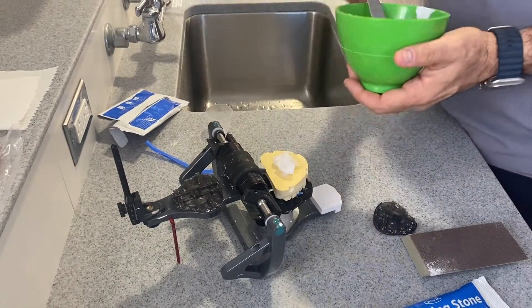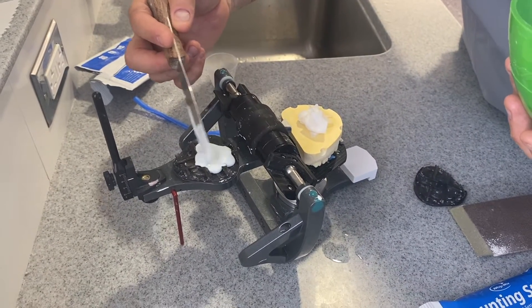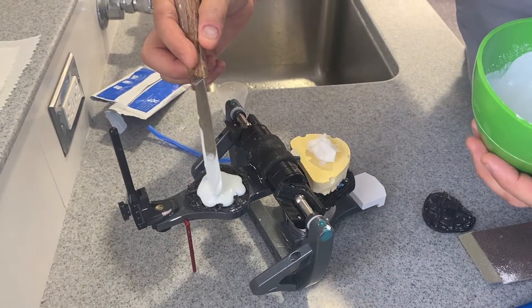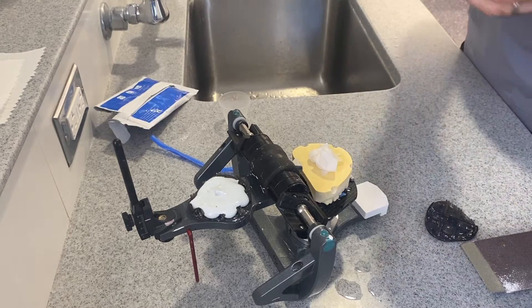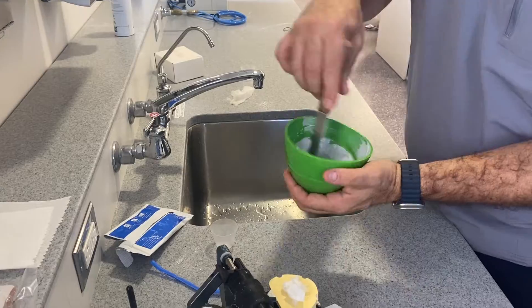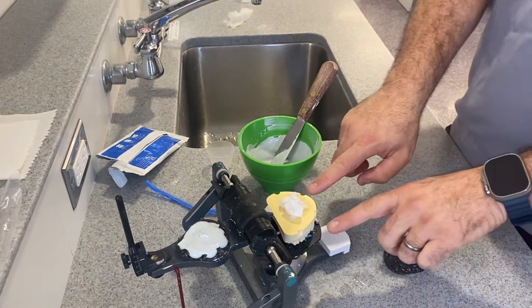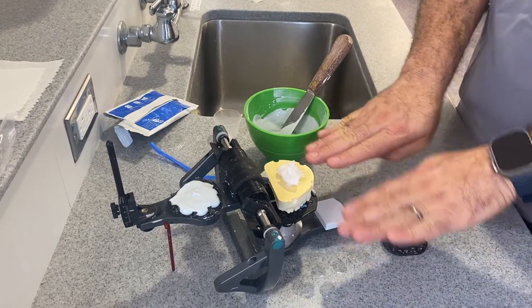Make sure you have this sitting horizontally, and you can start applying as it's runny — it'll get into the undercuts of the mounting plate. You want to reach those undercuts right there. Still wait because it's still too runny. At this point, make sure this is nice and flat and the occlusion is not tilted to one side or the other but pretty flat.